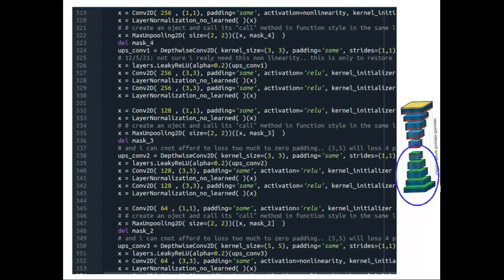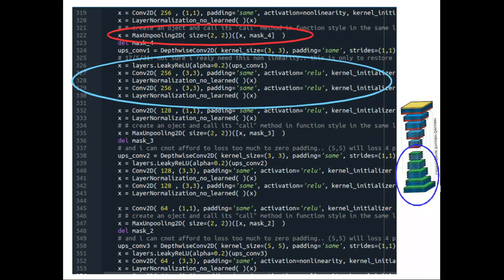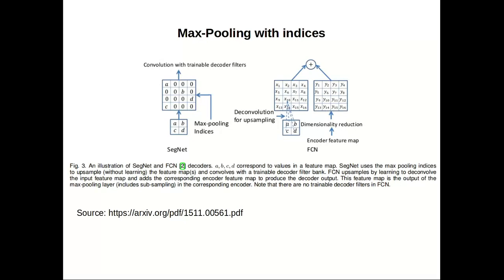After the latent representation comes the decoder part of the denoising autoencoder, where the model gradually projects the compressed representation back to the original dimension. Notice that I didn't use deconvolution layers here; instead I used an upsample operation followed by a regular convolution. The advantage of this alternative technique is that it prevents a checkerboard artifact that frequently results from using pure deconvolution operations.